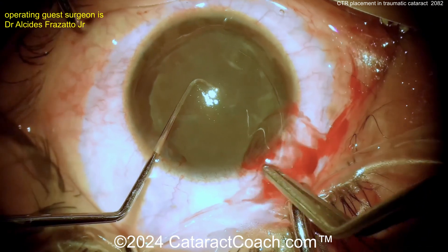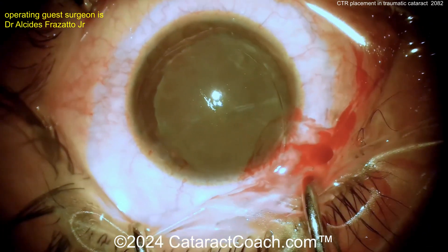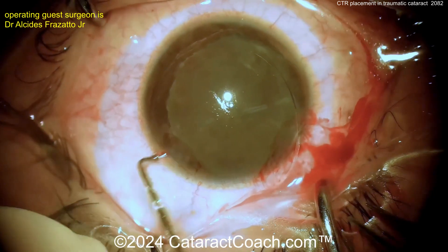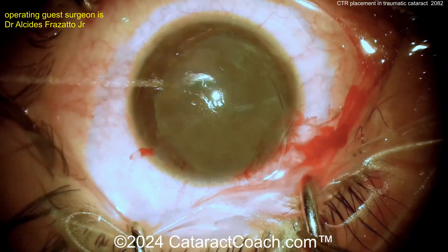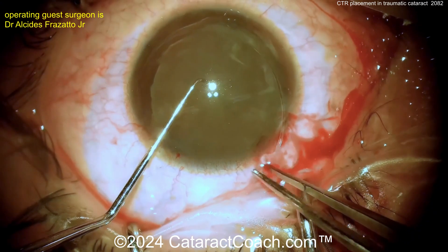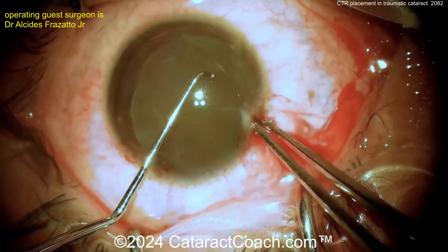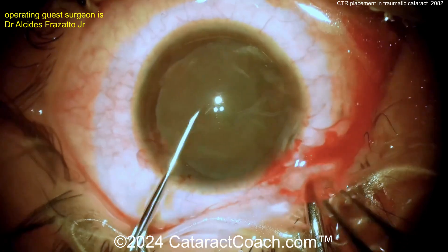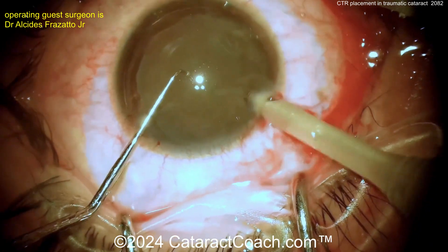That kind of helps delineate where the capsular bag equator is. So now you know this edge of what you see — the nuclear opacity — that's just some inner nuclear layers. The epinuclear shell is probably clear in this patient, and that's why it looks like that. Very nicely done.